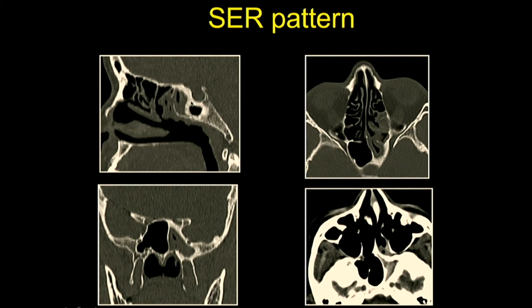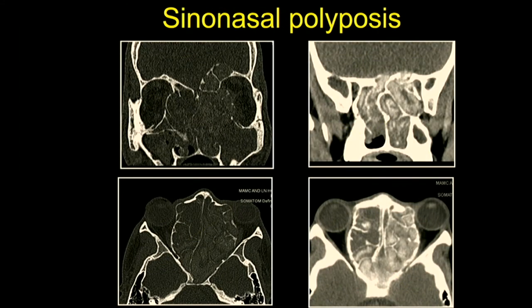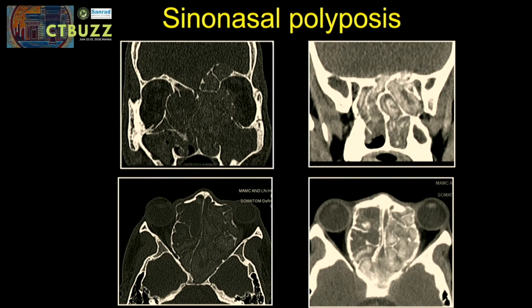The sphenoethmoidal recess pattern involves the posterior group of sinuses. We see mucosal thickening involving the sphenoid sinus with blockage of the ostium and recess, seen well on both sagittal and axial images — the sagittal being a little easier to evaluate the sphenoethmoidal recess pattern. There is mucoperiosteal thickening leading to sclerosis of the bony walls and hyperdensity within the ipsilateral sphenoid sinus.